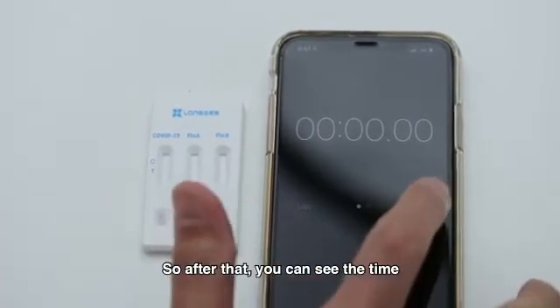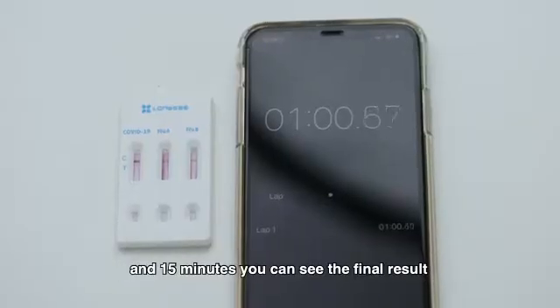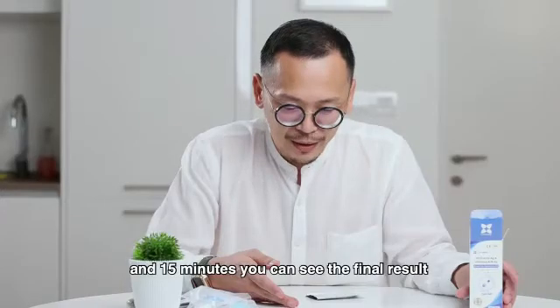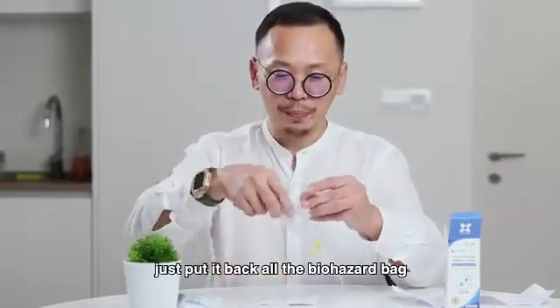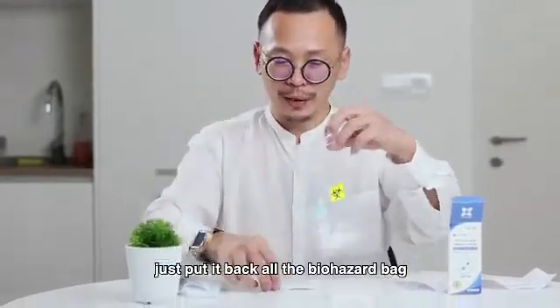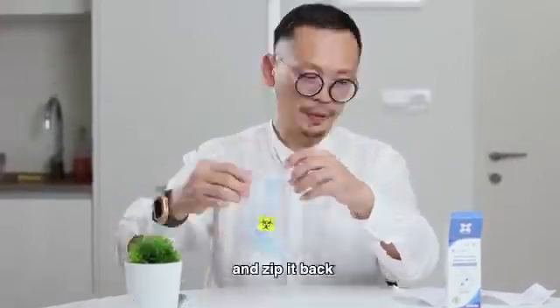So after that, you can see the time. Just wait for 1 minute and you can see the result. And at 15 minutes you can see the final result. So remember, your container and everything — just put it back in the biohazard bag, and zip it back.